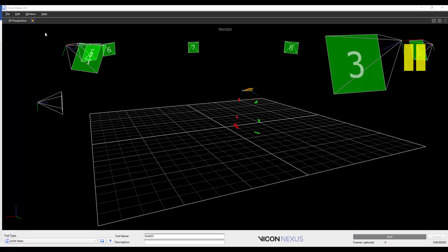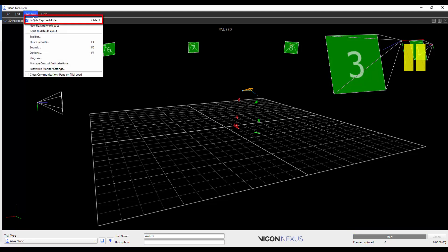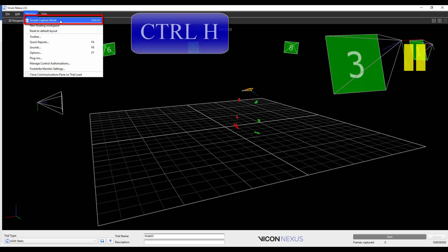To exit the Simple Capture Mode, you can either go to Window, and select Simple Capture Mode again, or you can press Ctrl H on the keyboard.